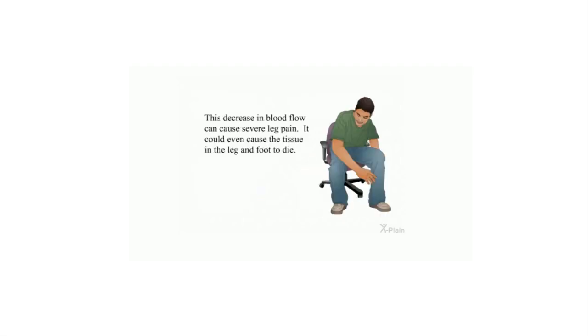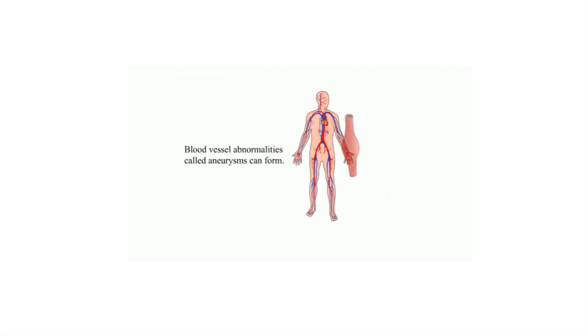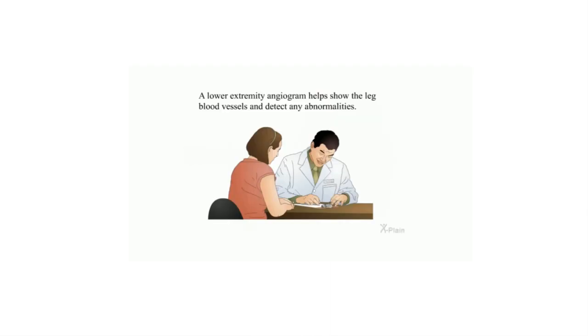This decrease in blood flow can cause severe leg pain. It could even cause the tissue in the leg and foot to die. Blood vessel abnormalities called aneurysms can form. A lower extremity angiogram helps show the leg blood vessels and detect any abnormalities.